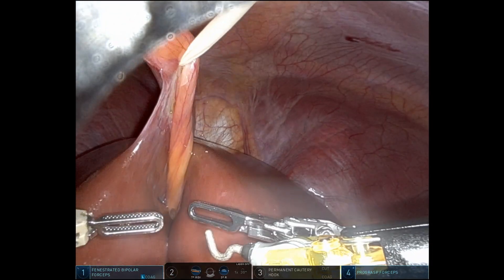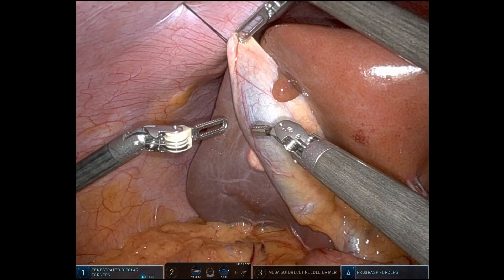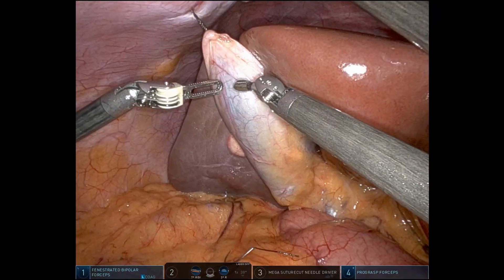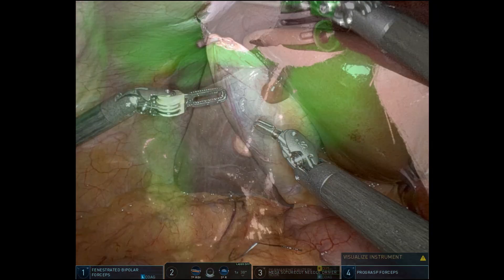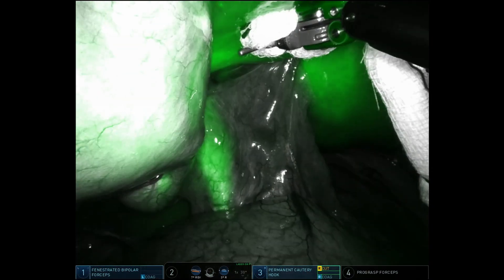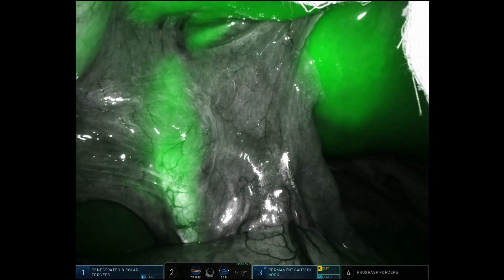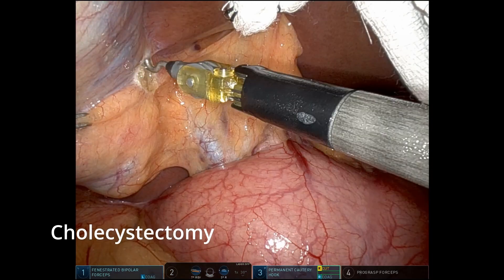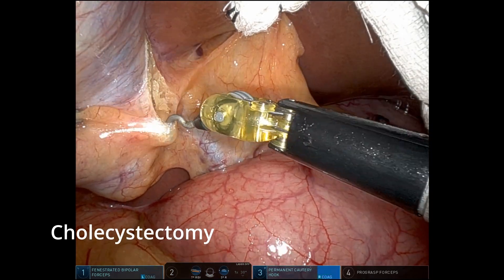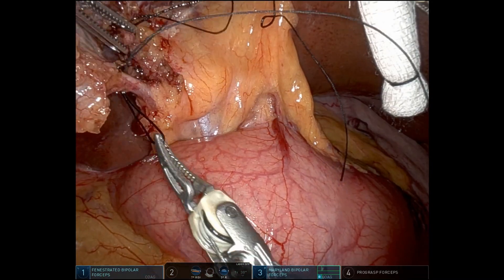First, we need exposure. So we always place a Penrose drain to pull up on the falciform ligament. If the gallbladder is intact, you can actually use that as traction as well to expose the hilum. Here the patient had been given ICG in the preoperative area about an hour and a half before surgery. Here we're doing a cholecystectomy.